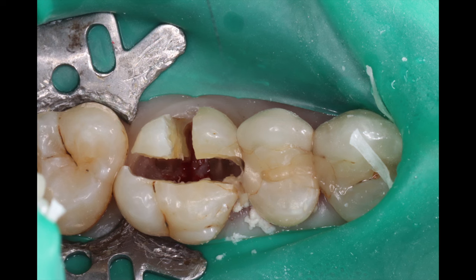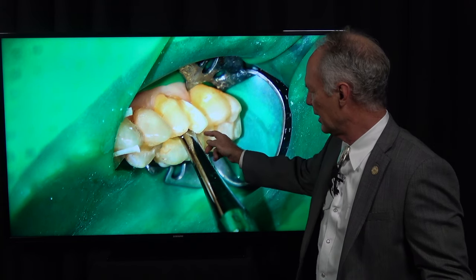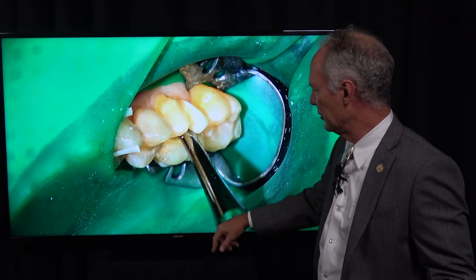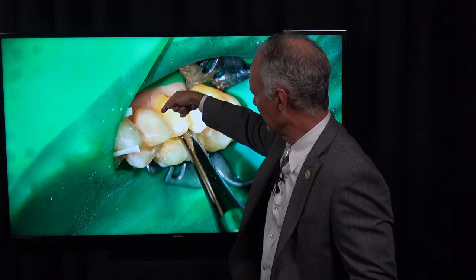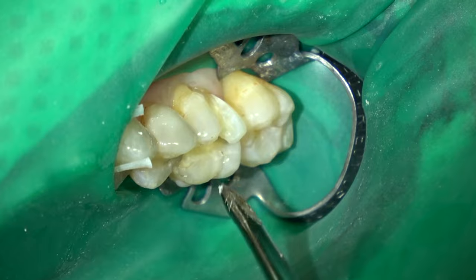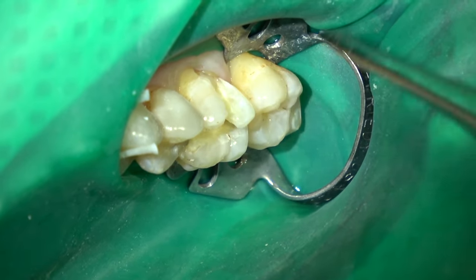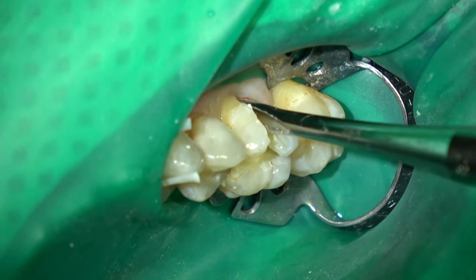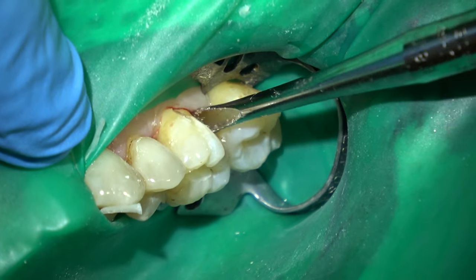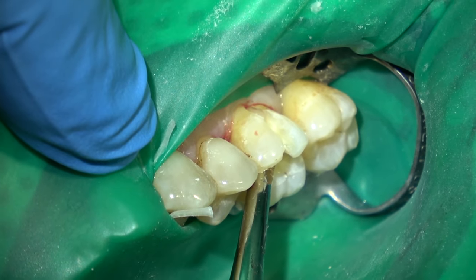I've cut all the way through the furcation. Then I'm going to very gently torque these pieces — I'm going to put this elevator in between the buccal roots and between the buccal roots and the palatal root. I'll also place the elevator on the mesial and distal of these buccal roots and just very gently torque them to loosen them so they'll pull straight out. Got to be very gentle because the buccal roots are very fragile.